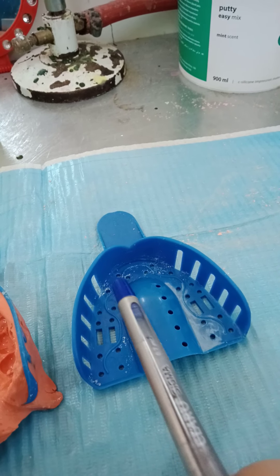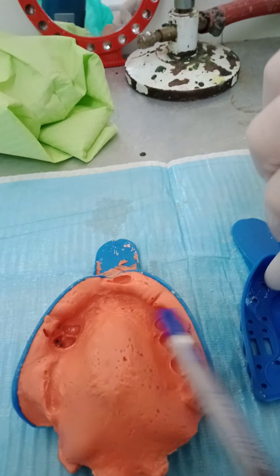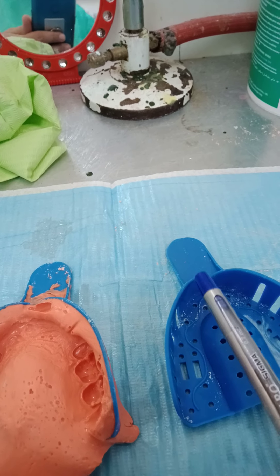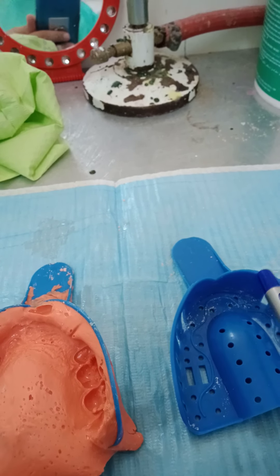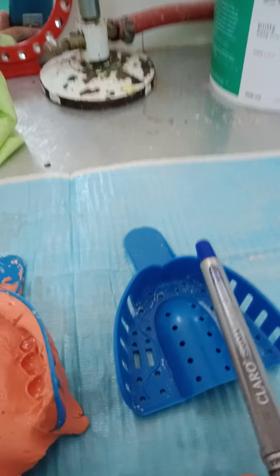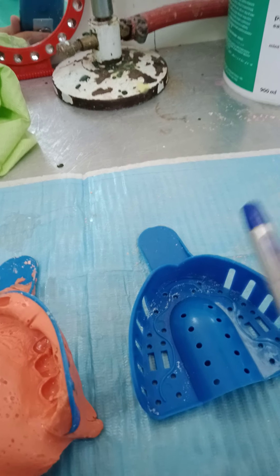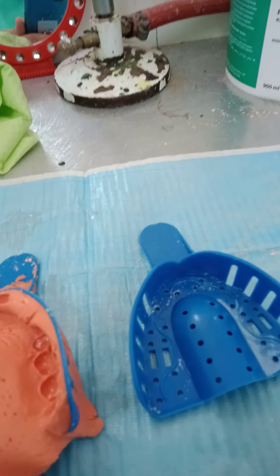A piece of compound in the saddle area — in between these two teeth — you're going to add compound, press it in place, then border mold over it. You've taken the anterior ridge compressed and you've taken the sulcus correctly. For border molding, use the same brown compound material, or you can add a green stick to it if you like a more flowable material. The compound will act for the compression and the border molding will give me the sulcus recording I need in this area.